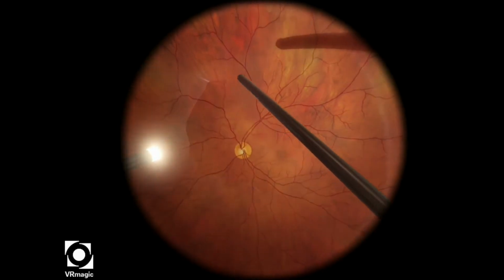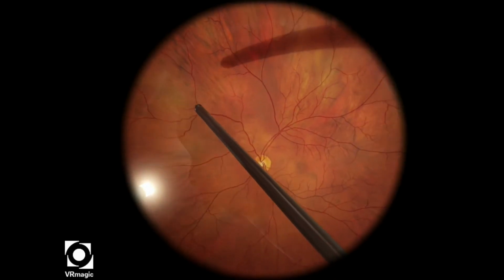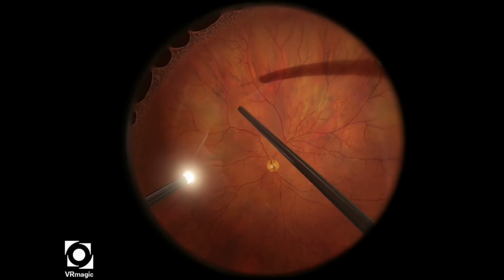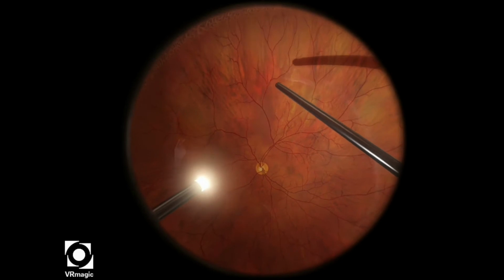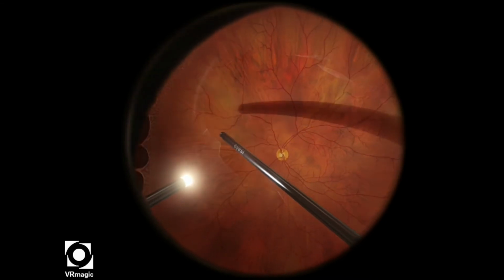So here a PVD has been induced. Again, I try not to pull too far into the periphery in concern of possibly inducing a retinal tear. And instead I pull segmentally some sections of the hyaloid off before cutting it and creating a bit more space. So here I can tell where the edge of the hyaloid face is.